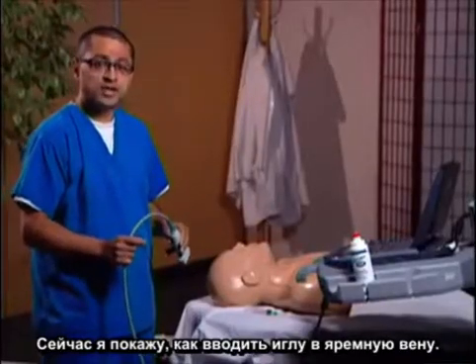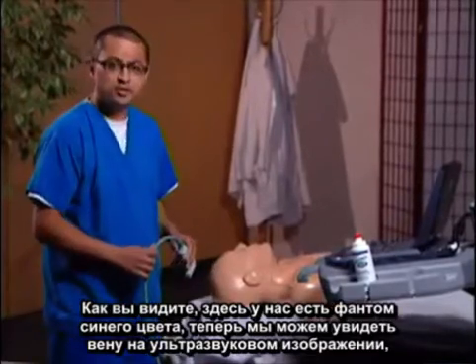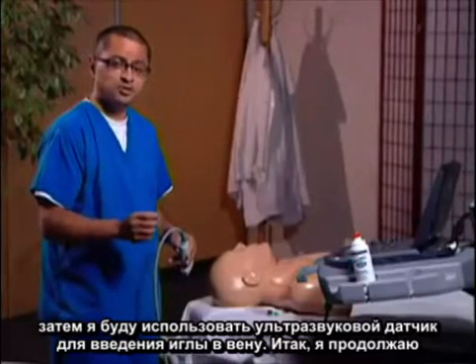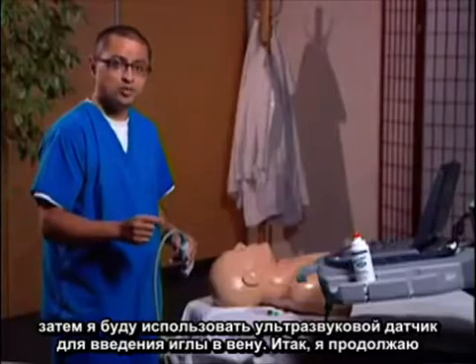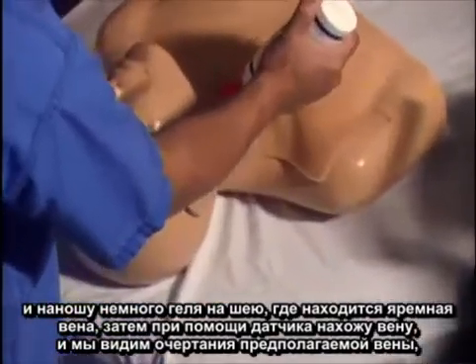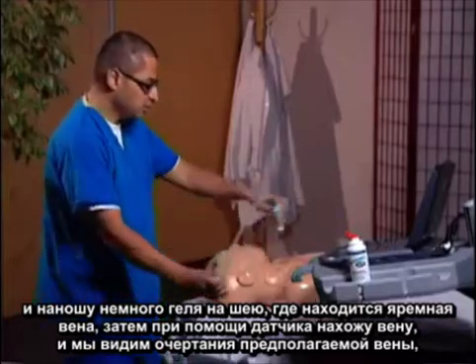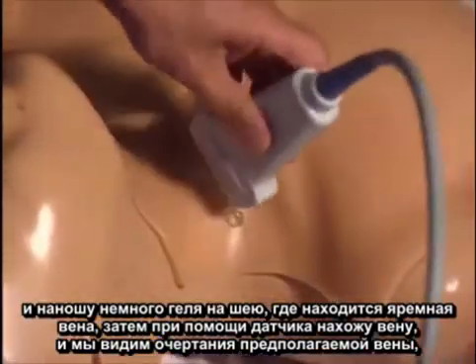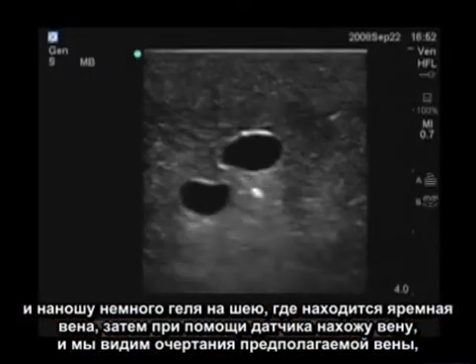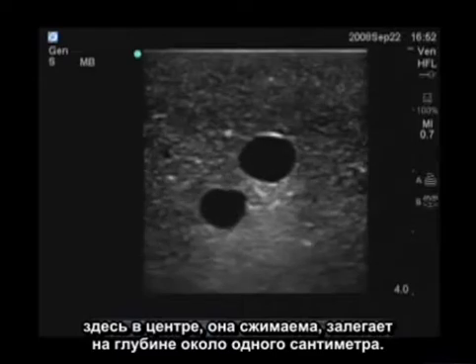I'm going to show you how to use ultrasound to actually guide your needle into the internal jugular vein. As you can see, we have a blue phantom here. We're going to take a look at the vein first with ultrasound, then use the transducer to guide the needle toward the vein. I'll place a little bit of gel onto the neck where I expect the jugular vein to lie, and use the transducer to identify it. On the image, we can see what is the vein here in the center — it's compressible and about a centimeter deep.